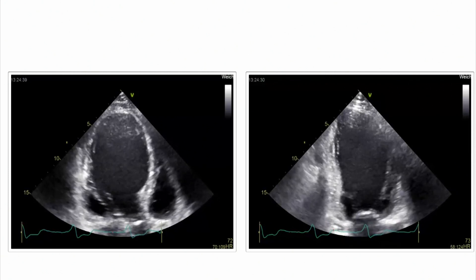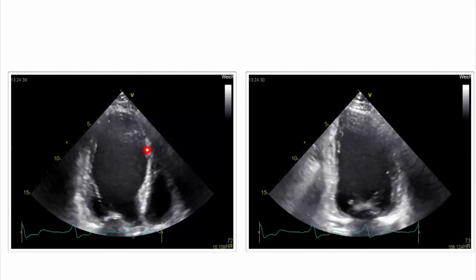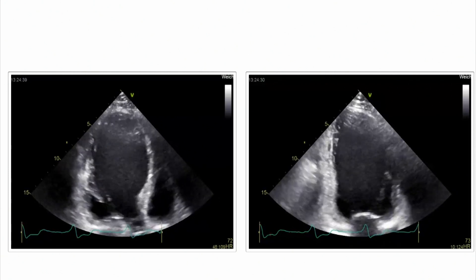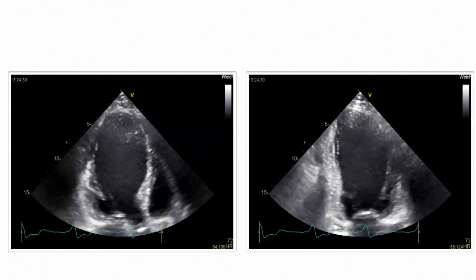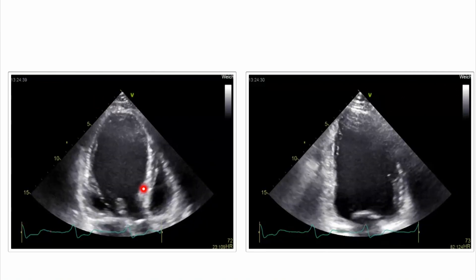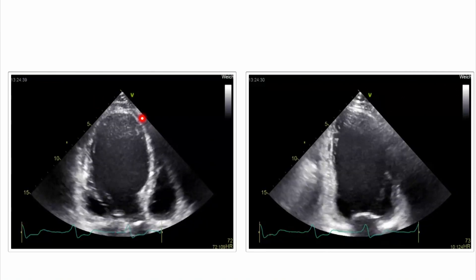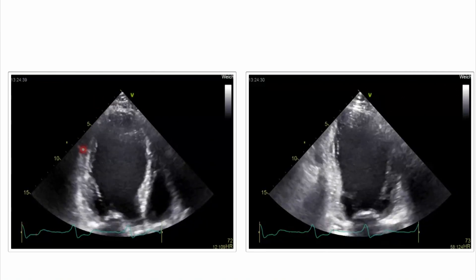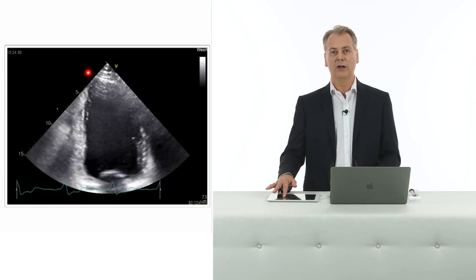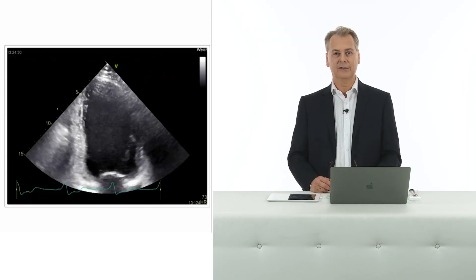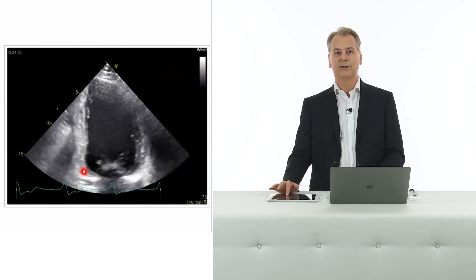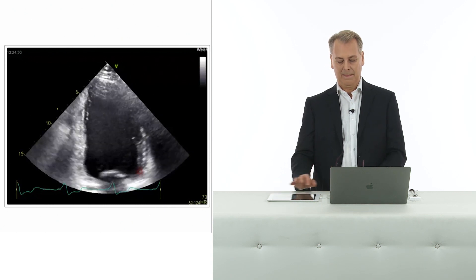Here is the apical long axis view and the two-chamber view. If you're good at detecting regional differences, you will see that the anteroseptal region, the apical region, and even the anterior wall are not contracting normally. There is better contraction here in the basal segments.